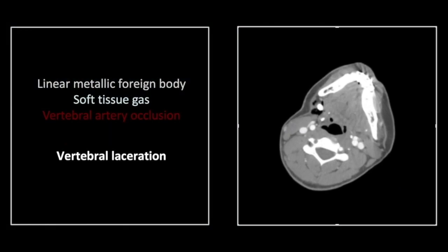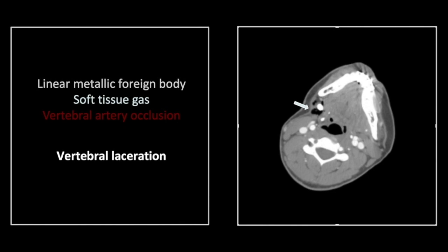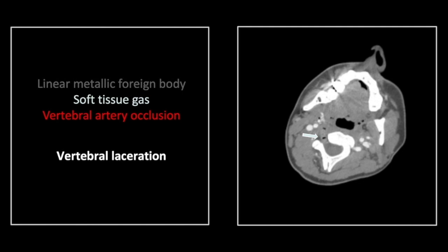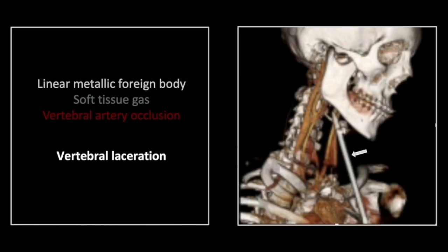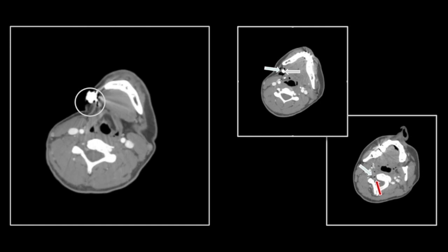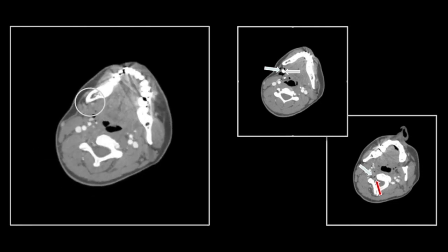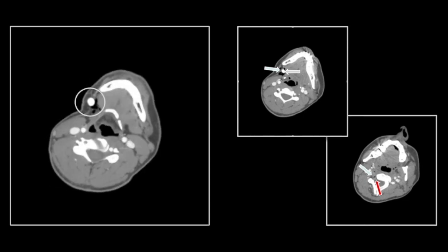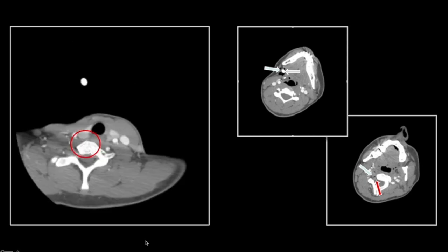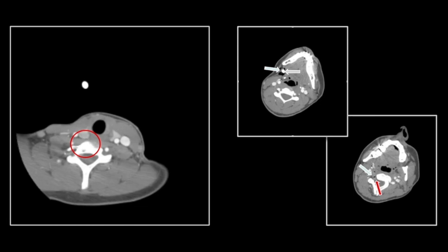Our next case is a vertebral artery laceration. You can see there is a metallic foreign body — this was actually an archery mishap, so that is an arrow. There is adjacent soft tissue gas, and most importantly, there is no contrast enhancement of the right vertebral artery. Here is the offending arrow. They were wise enough not to remove it completely, but its presence, partially within the soft tissues, is misleading because it suggests to the viewer that the arrow did not penetrate as deeply as it actually did. You can follow that right vertebral artery and see you lose it quite quickly.